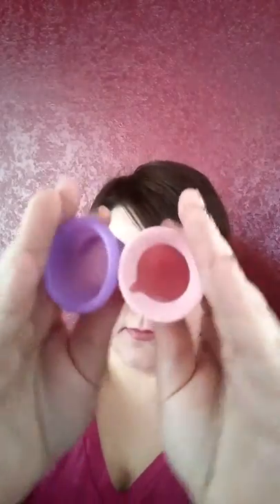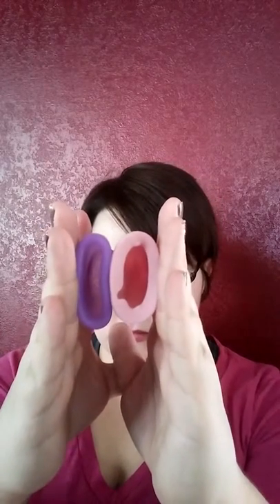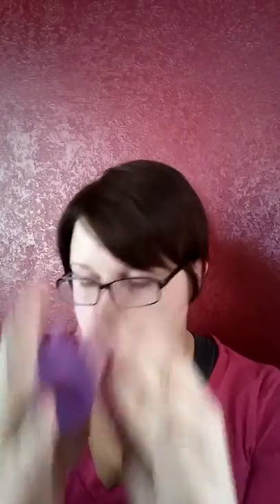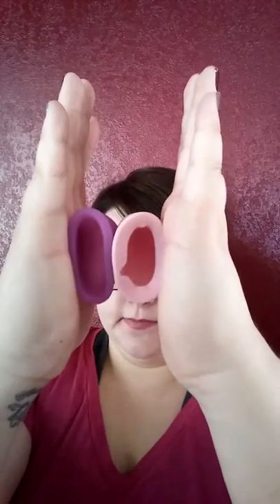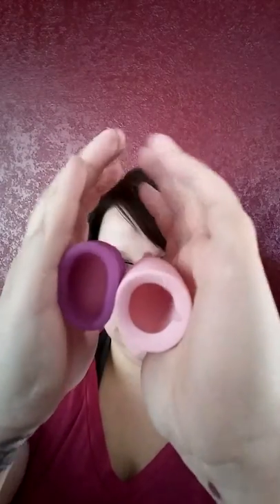Here's my Anytime cup, here's my Lena — these are really hard to do a rim test on. And here's the Lunette. This is like impossible to try and do.